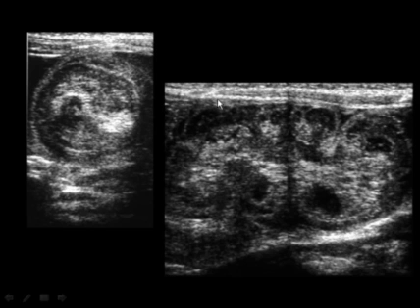So here's a patient with a Meckel's diverticulum, which I think you can see here. It's this very bright lesion here on a stalk. It's harder to see on the sagittal view. This really does look more like a kidney than that first case that I showed you.